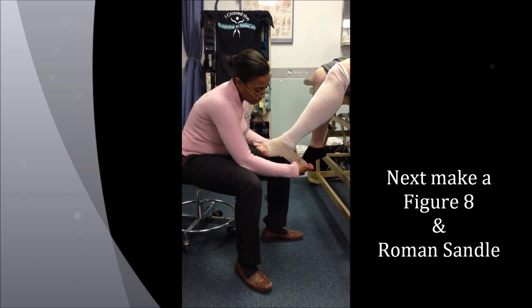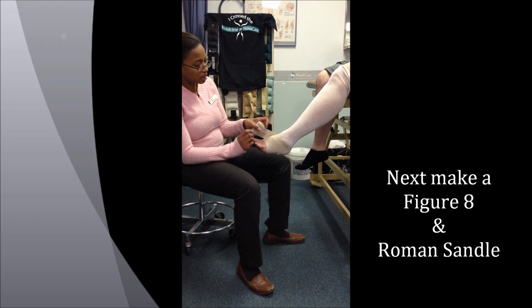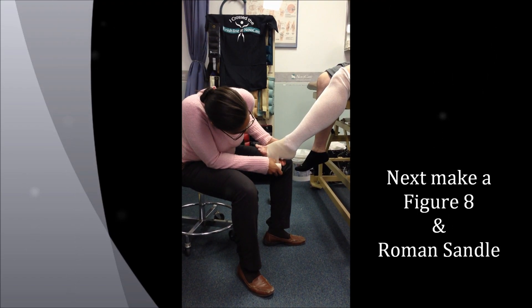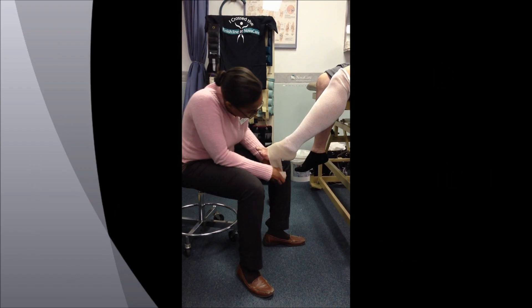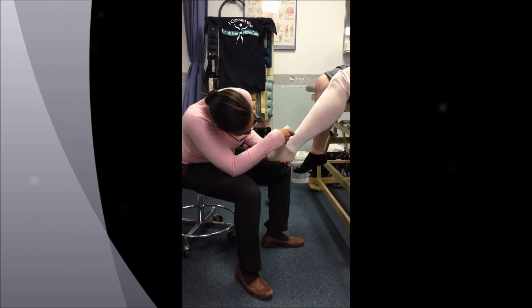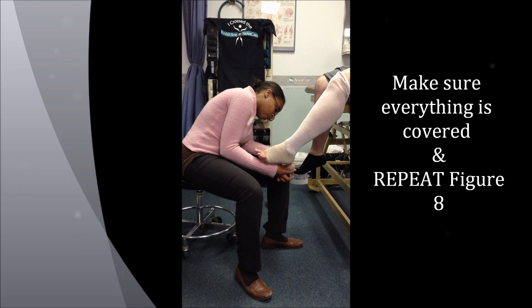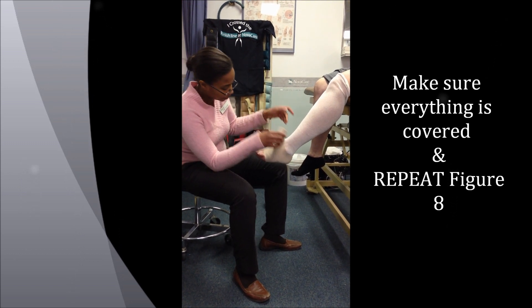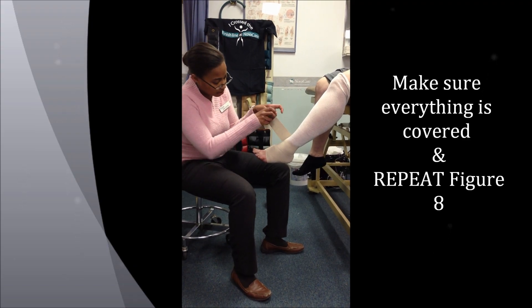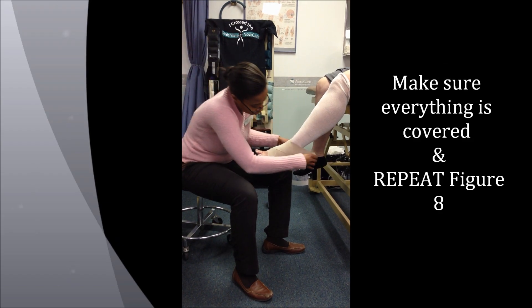You then do what's called a Roman sandal, where you come around the heel to the side and back down. What you're trying to do at this point is get everything covered underneath so that it is not wrinkled. Once you're finished with that, you then do your figure eights where you go down, around, across.